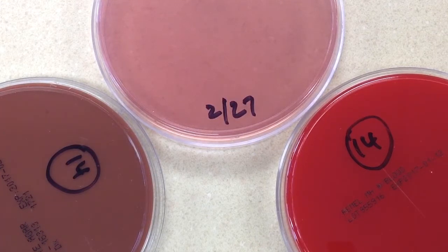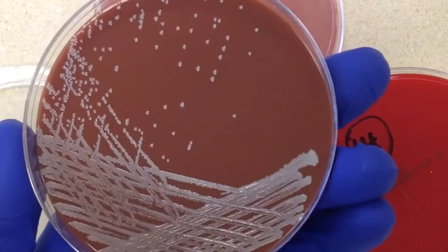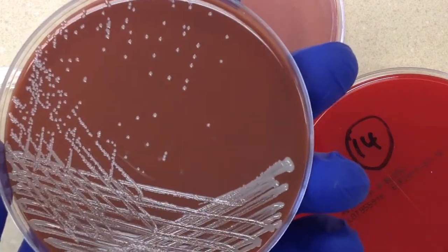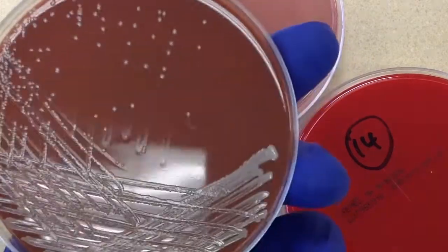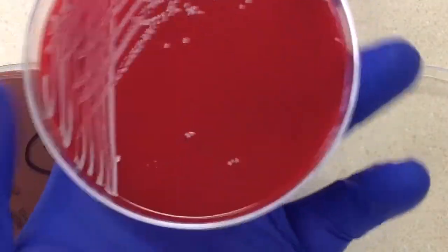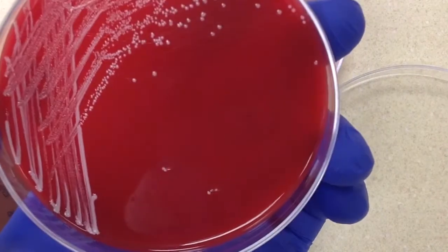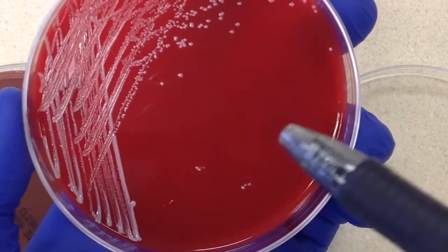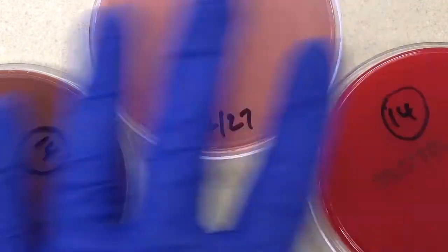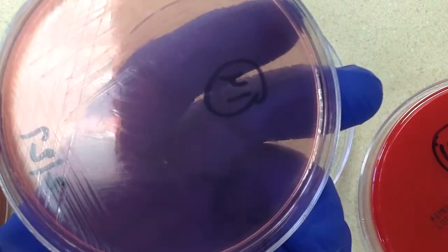Let's take a look at our plates. On our chocolate plate, we have slightly off-white, a little bit shiny colonies — looks like just one type. On our sheep blood, similar situation. I'm going to call the colonies on the sheep blood plate the same as on the chocolate plate. Our MacConkey's plate has absolutely no growth.